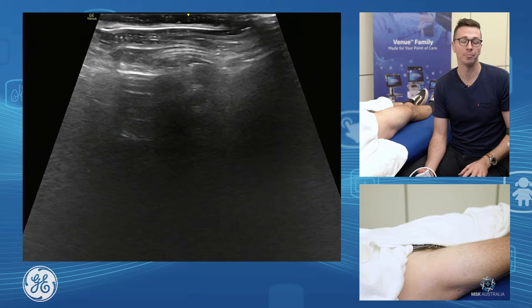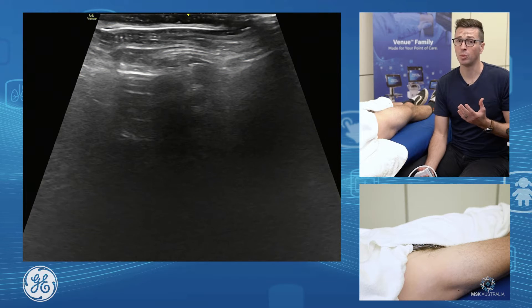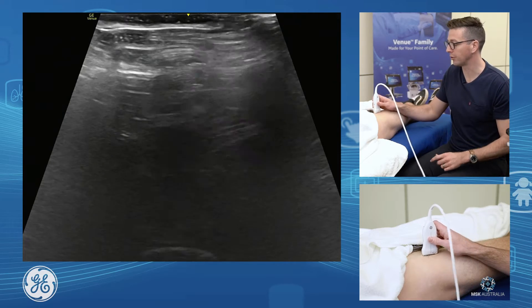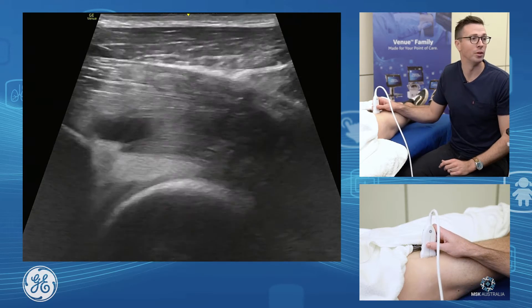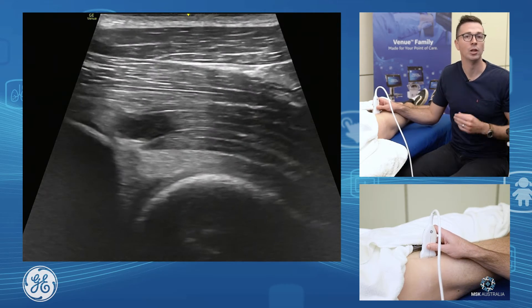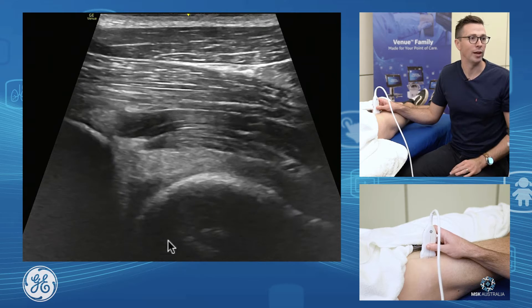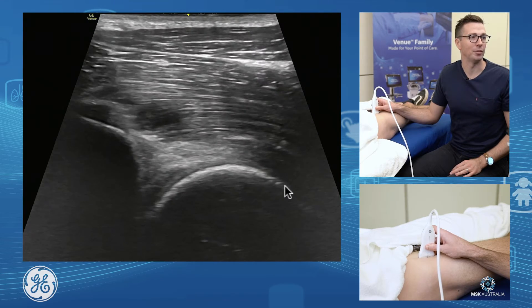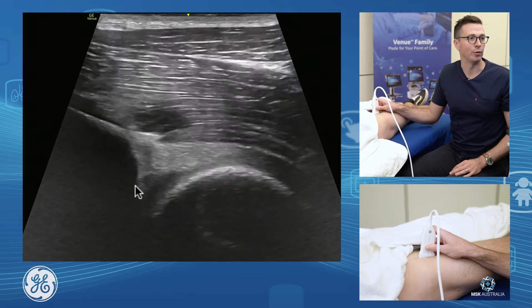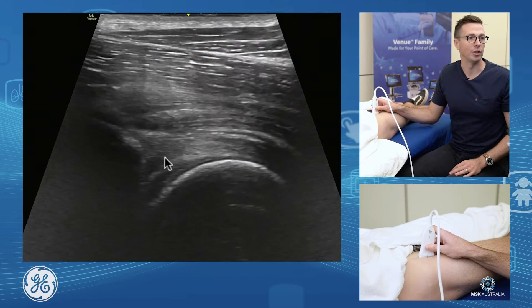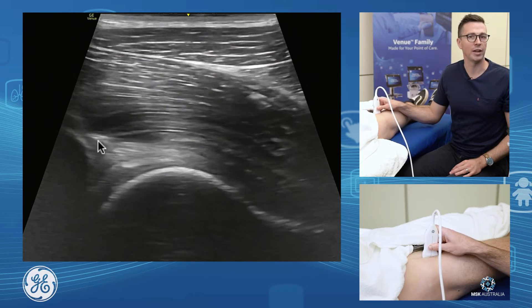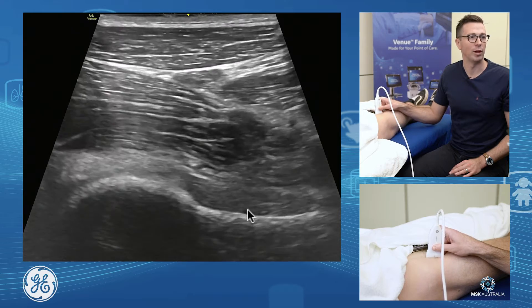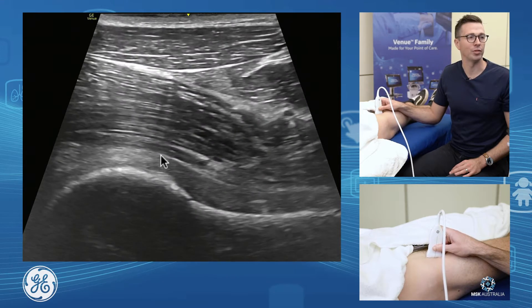Anterior Hip Joint Assessment. We're going to assess the hip joint proper itself. We'll find the anterior hip, put our probe straight on the front, and have a look. We'll identify our femoral head, the anterior aspect of our acetabulum, and the front triangular shape of the anterior labrum. Then we'll scan down and assess the femoral head-neck junction, and have a look at our hip joint capsule itself.